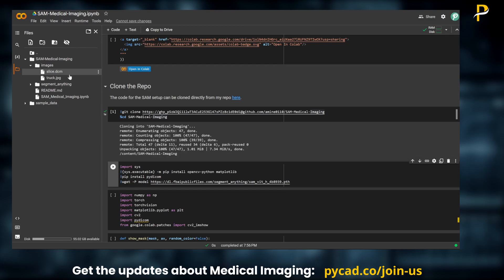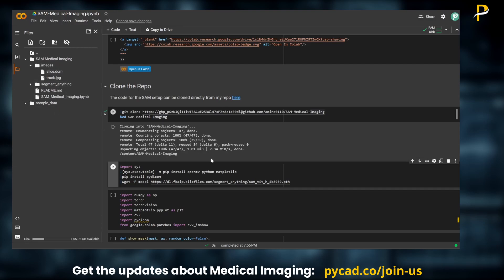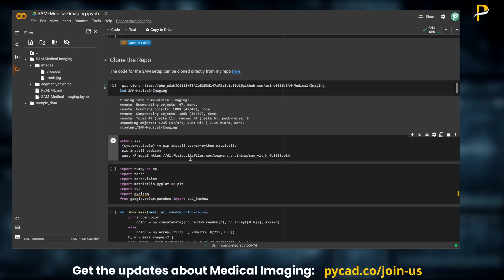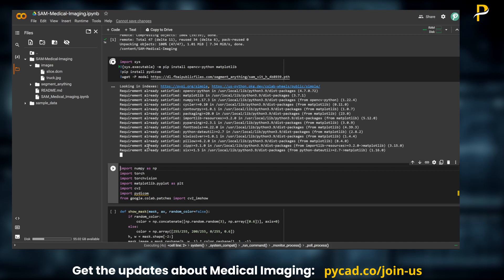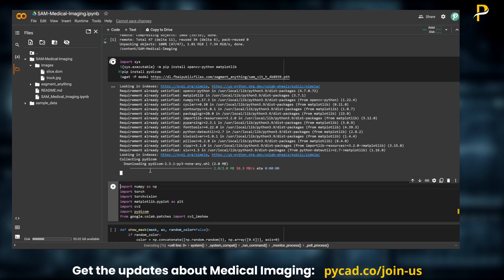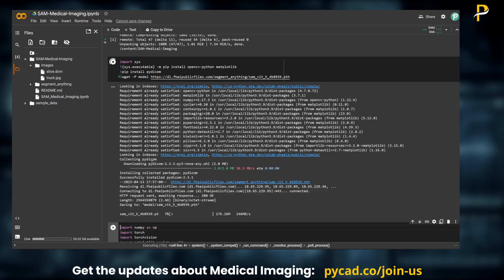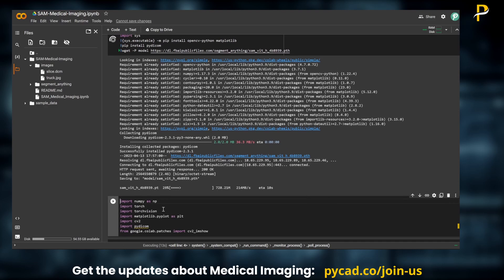If you want to upload your own files, you can right-click and upload files to test with the same code. After cloning the repository, you need to install some dependencies — they only had OpenCV and matplotlib, and of course they download the model checkpoint. For my version, I also added pip install pydicom because we need pydicom to read DICOM files. Let's run it and wait until the installation is completed and the model checkpoint is downloaded.